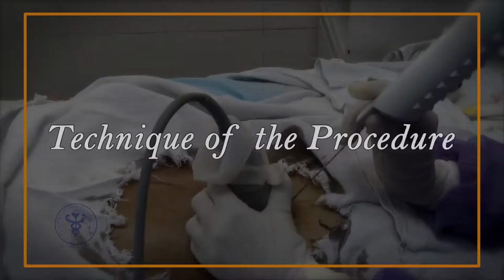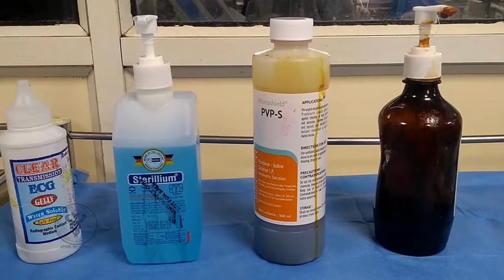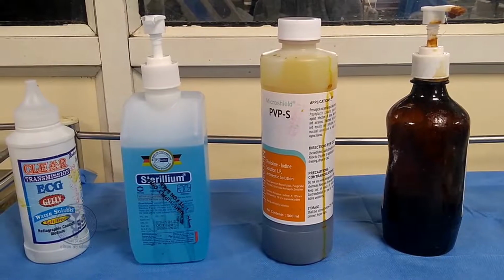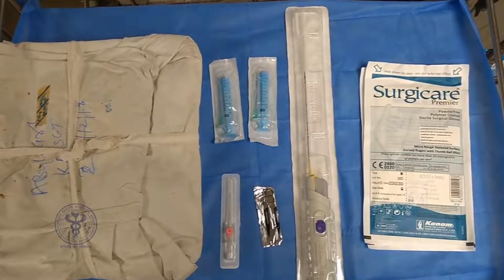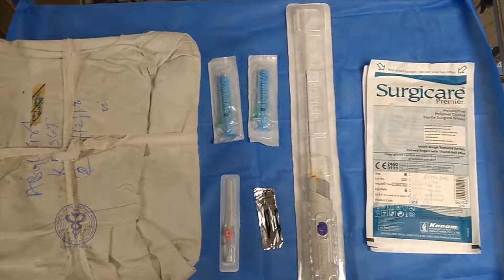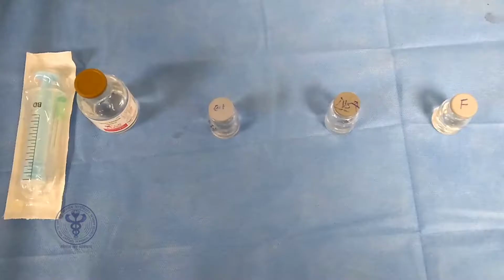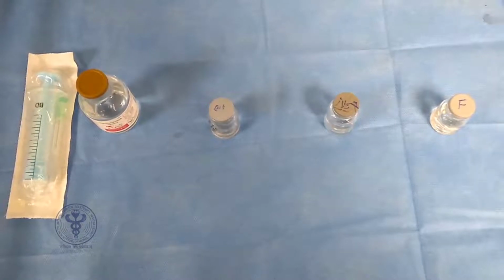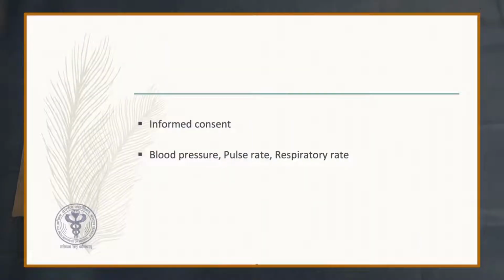Now we will have a look at the technique of a percutaneous native kidney biopsy under real-time ultrasound visualization in prone position. We will need an ultrasound machine with curvilinear probe, ultrasound gel, alcohol-based surface disinfectant, povidone iodine, surgical cut-down set, 2 10 ml syringes, 20 gauge IV cannula, number 11 surgical blade, automated biopsy gun of size 14 to 18 gauge, sterile gloves, local anesthetic agent, 3 vials containing formaldehyde, glutaraldehyde and normal saline. A proper informed consent should be taken from the patient after explaining the possible complications.